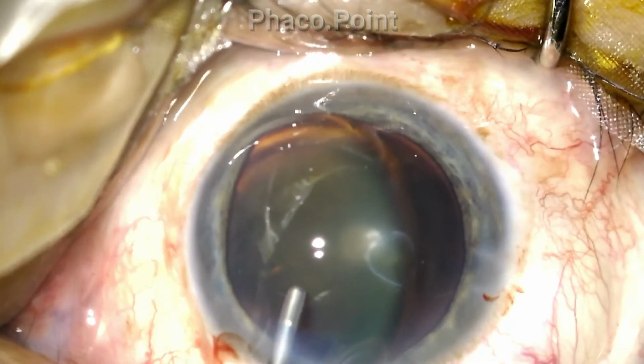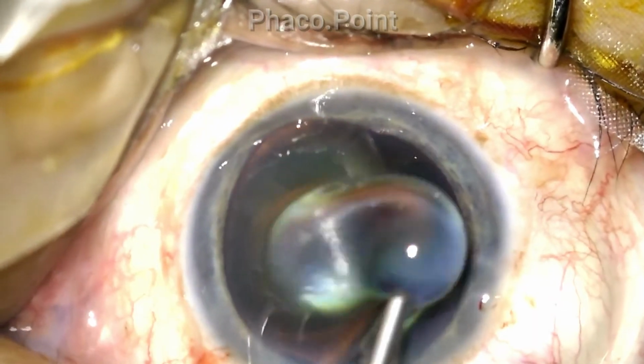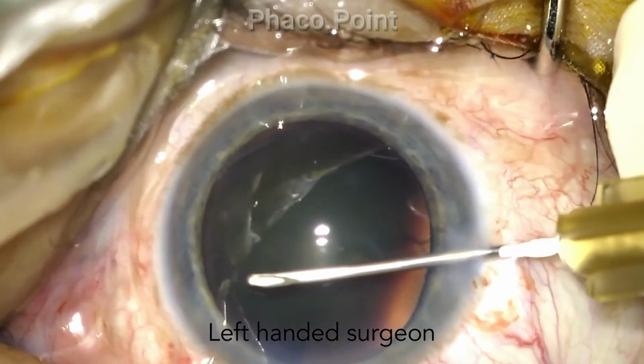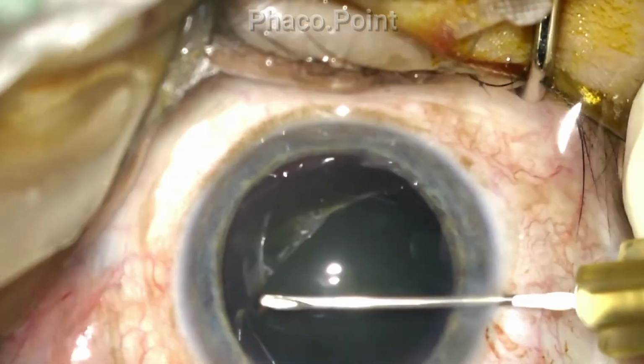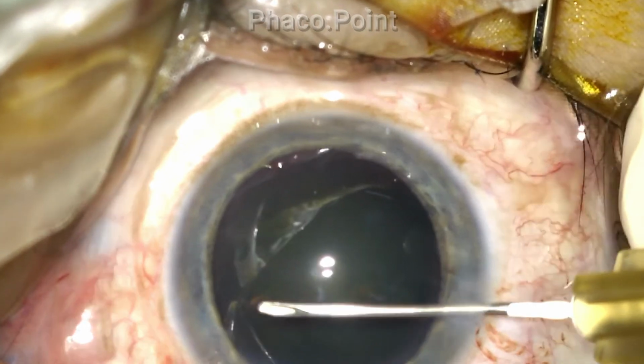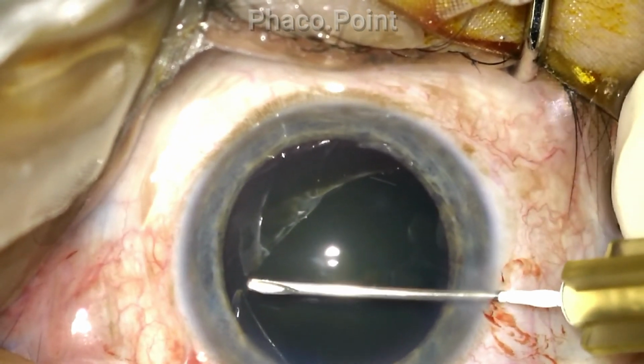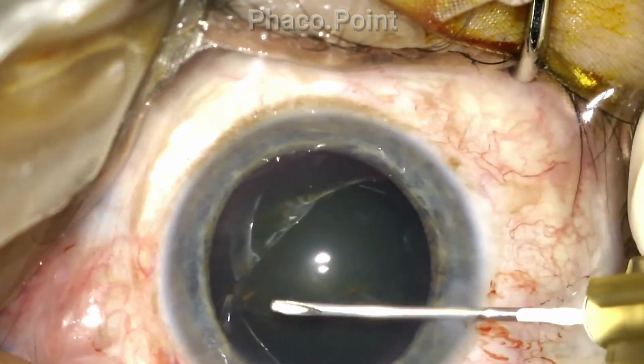After introducing viscoelastic into the anterior chamber, I now go with the capsulotome through the right side port up to the tear and attempt to now raise a flap. Raising a flap at this point is going to now enable me to hold on to the tear with the help of an intraocular forceps.